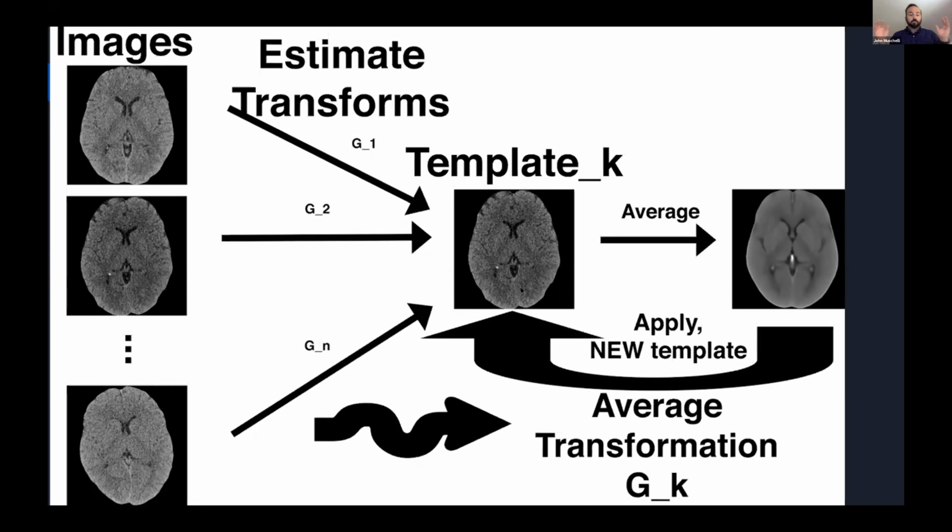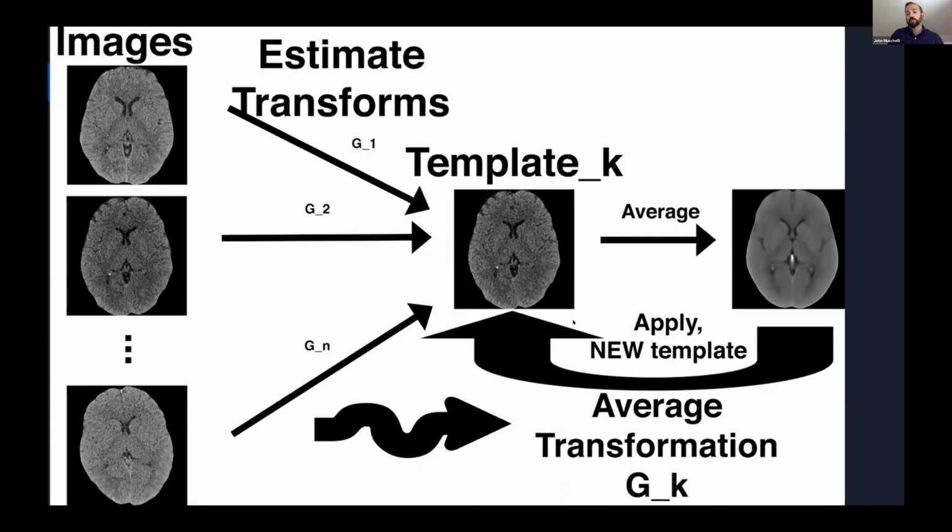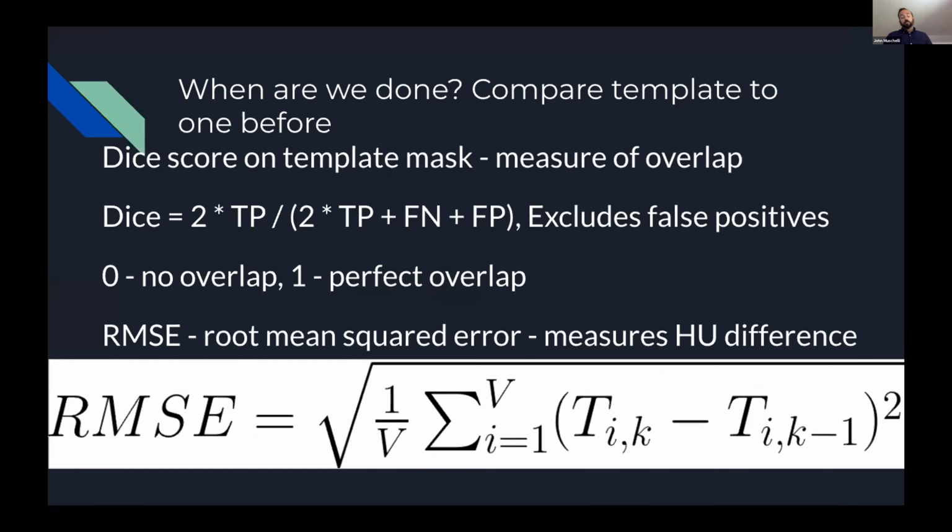So the long and short of it is that this is a gradient descent algorithm that's trying to estimate the true population map. We do this over and over and over again, and then we have to define some ways for convergence, or determining if we're close or good enough. So what are those two measures? Are we good enough? Is it converged?